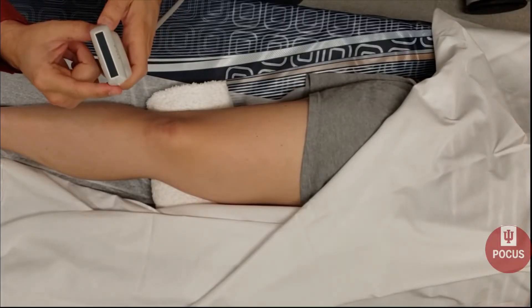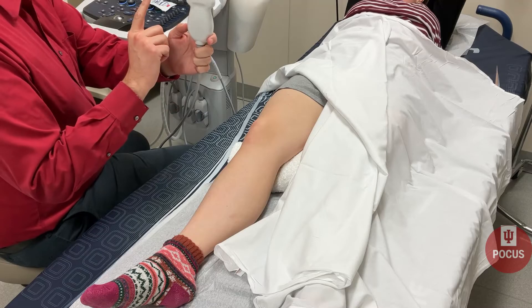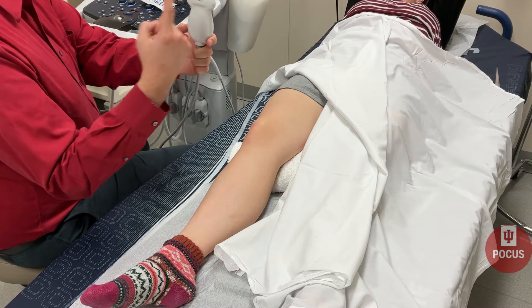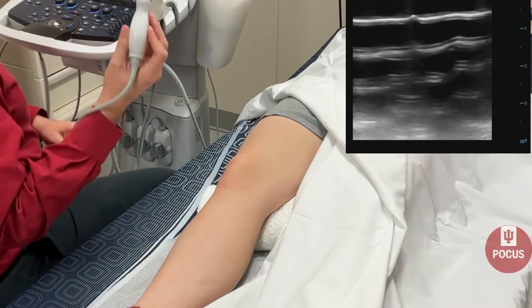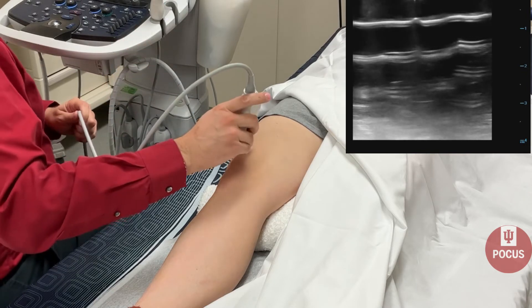With musculoskeletal ultrasound, make sure your marker dot is always pointed towards the patient's head or their right, or following along whatever tendon or structure you're looking at.